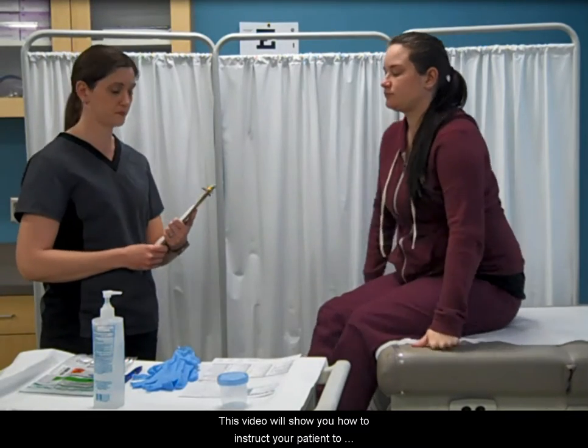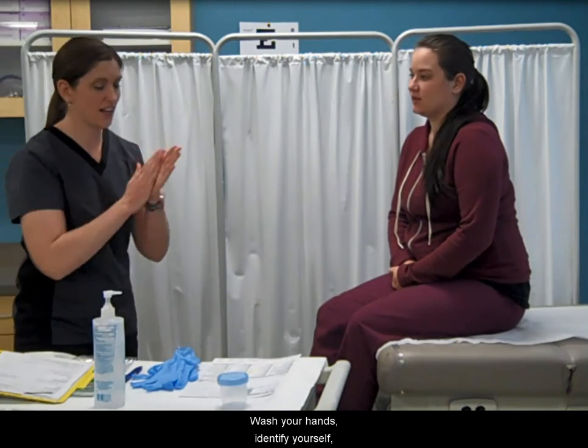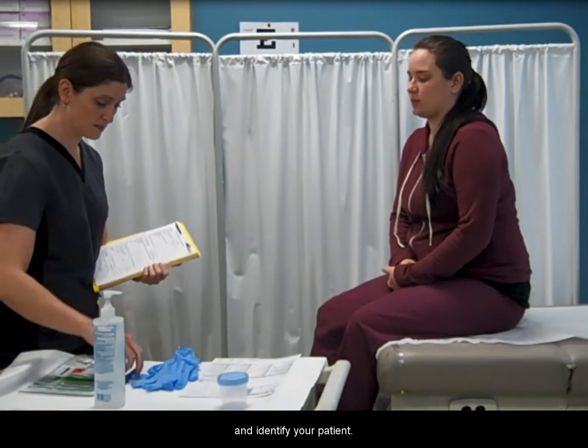This video will show you how to instruct your patient to collect a sputum specimen. Wash your hands, identify yourself, and identify your patient.